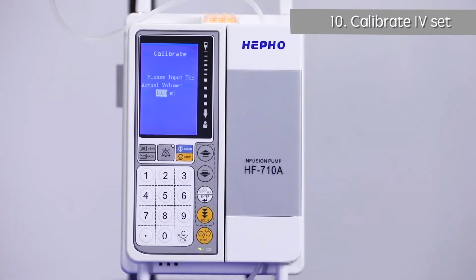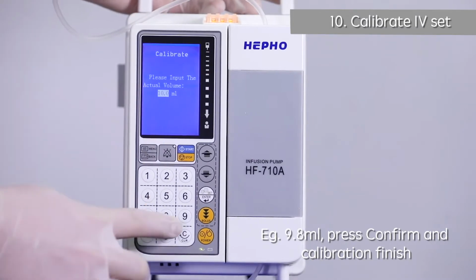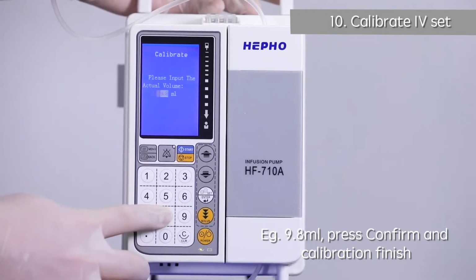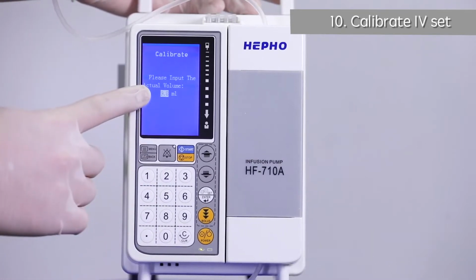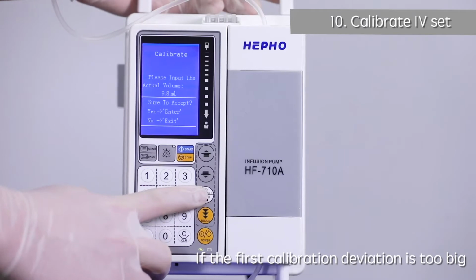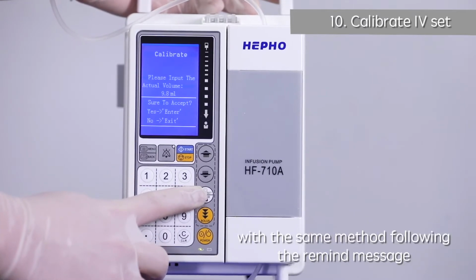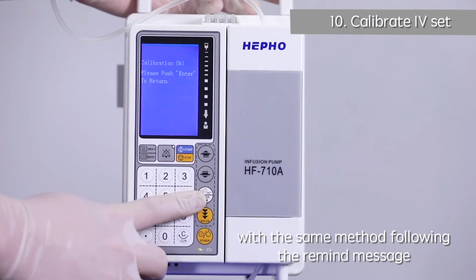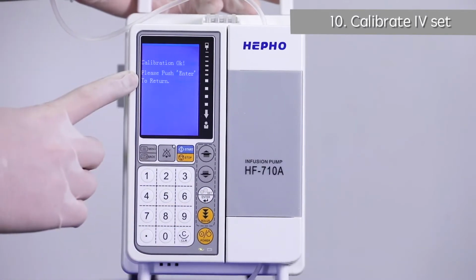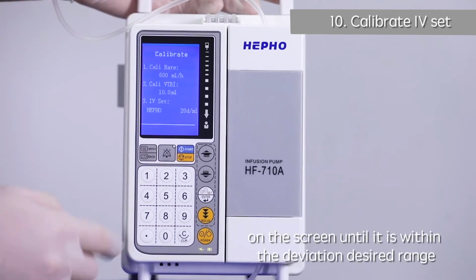For example, 9.8 ml. Press Confirm and calibration finish. If the first calibration deviation is too big, please do the calibration 1 to 2 more times with the same method, following the remind message on the screen, until it is within the deviation desired range.